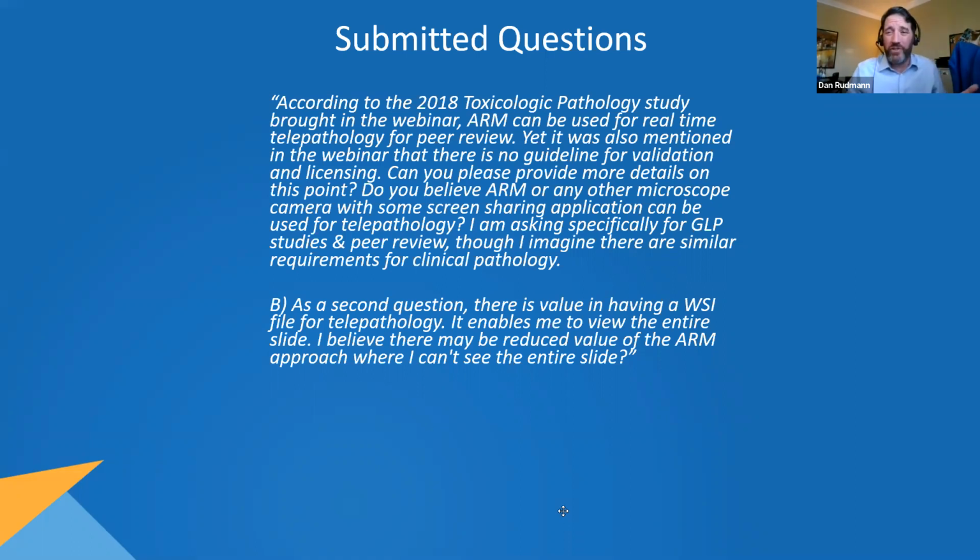Why waste your time scanning that? Why waste your time building the infrastructure and scanning that? Well, if you have a slide underneath the microscope and a trained pathologist who looks at the slide and says, I'm really interested to see what the computer thinks about this part of the slide, he or she goes right to that part, boom, and gets the decision support he or she needs. So I think it's a key difference to think about. I understand people always think more data is better, but sometimes more data is not better. Sometimes more data is more time, less efficiency, and distracting. So anyway, my thoughts.